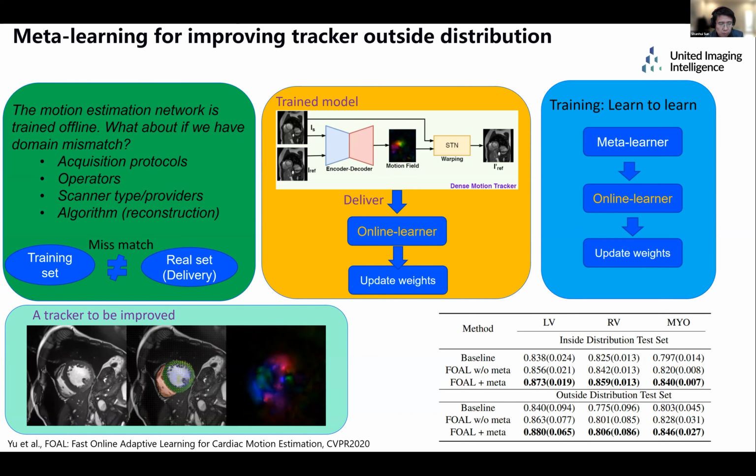From those data, we can fine-tune the neural network to overfit the weights to this data site. If we can overfit to just one single data, we can get a good performance.